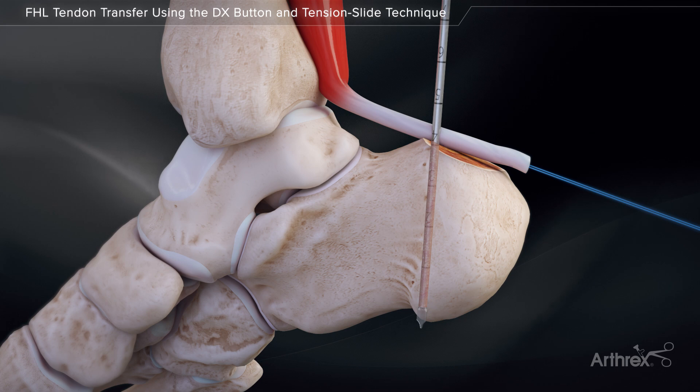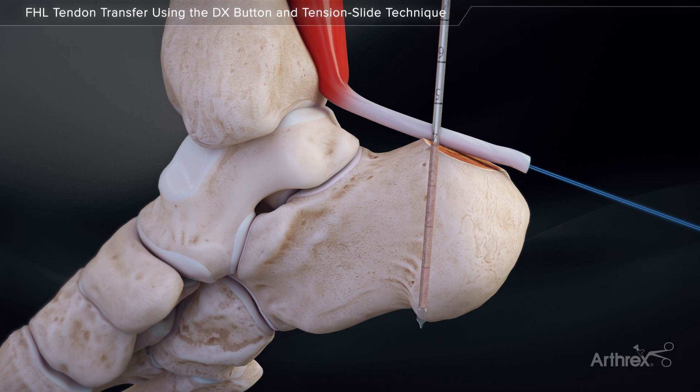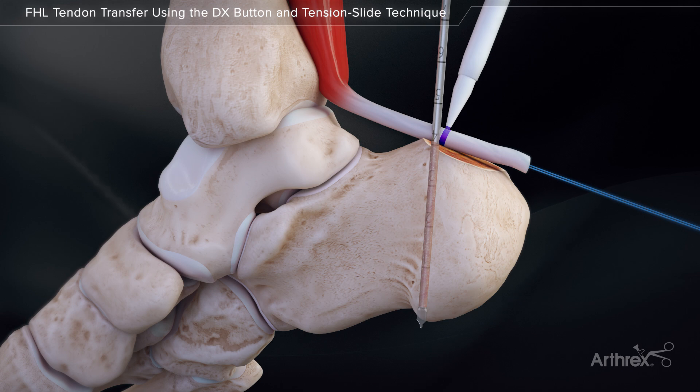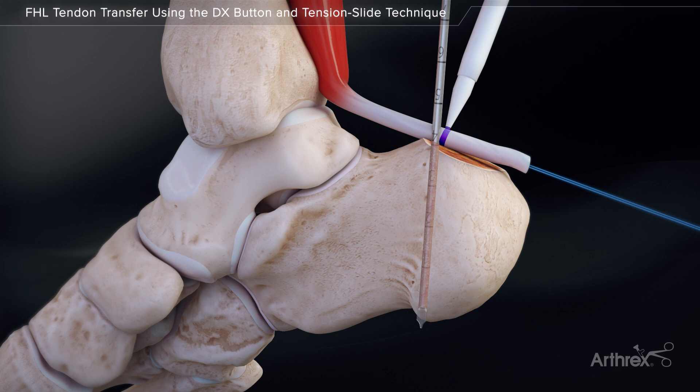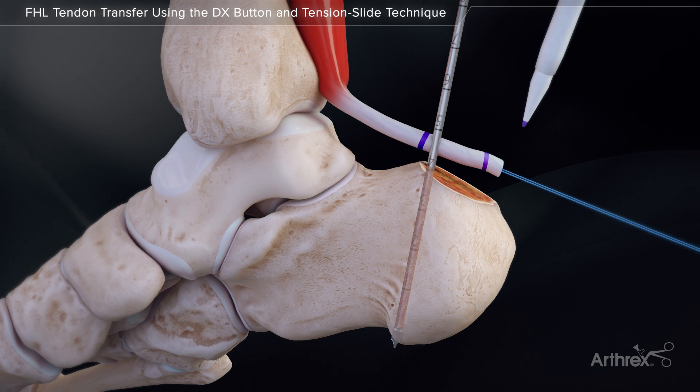Plantar flex the foot and pull the traction stitch so the FHL is tensioned appropriately at the interface of the bone and drill pin. Use a marking pen and mark the entry point of the tendon. Determine the length of the tendon that will pass into the tunnel — this will be either 15 or 23 mm — and make a second distal marking.